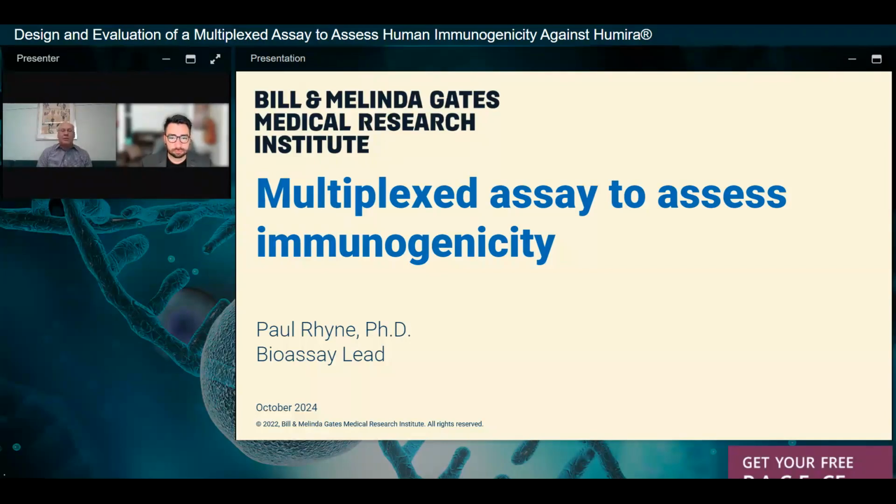And that differs a little bit from the bridging assays that you see on the MSD and the colorimetric ELISA assays. And this data set shows that it does work. It works fairly well, and it has comparable sensitivity and drug tolerance to what you would get with these other types of technology. So it came out really nice. We're really proud of it.